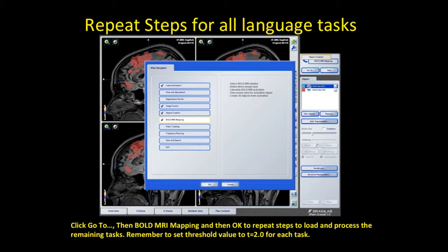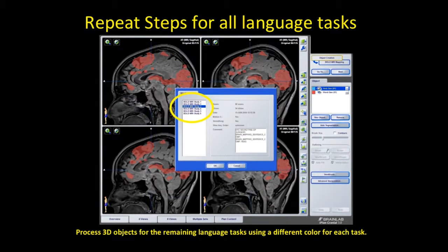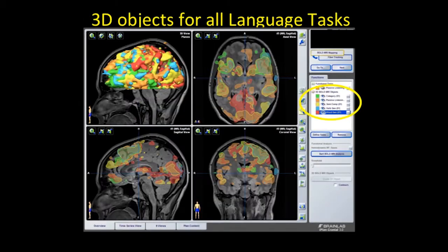Repeat all those steps again for the other language tasks. Click go to bold MRI mapping and OK, and remember to keep your threshold constant at 2.0. Use a different color for each task — it's easier to remember and identify which task is which. We went through all these language tasks and made 3D objects: a category task, passive listening, sentence completion, word generation, and verb generation. All the eye icons are open.